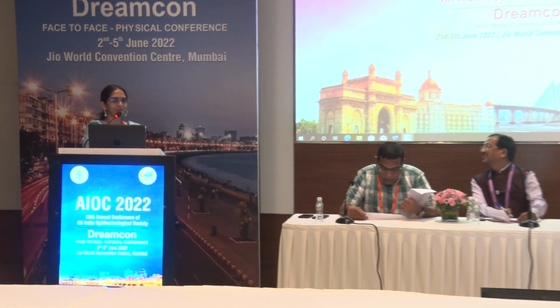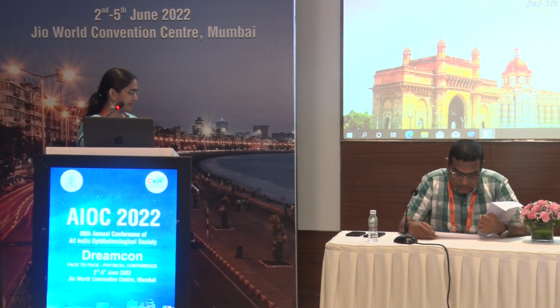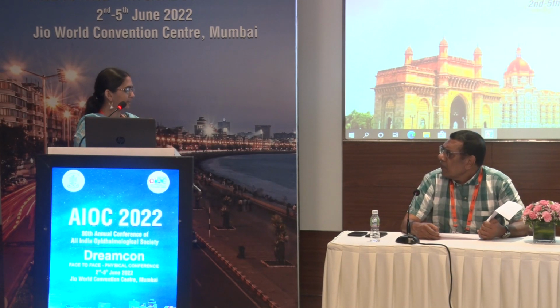Sir, Nanda sir. Hello, sir. How is it better than the other two? I'm not saying this is comparable with the regular fundoscopy examination or fundus camera. This is basically for rural areas where there are not many facilities. The regular physicians can just have this instrument and try to detect it early and refer to the ophthalmologist. I'm never saying that this is a diagnostic tool for diabetic retinopathy. It is just for the physicians or RMPs, who normally dominate in our rural areas.